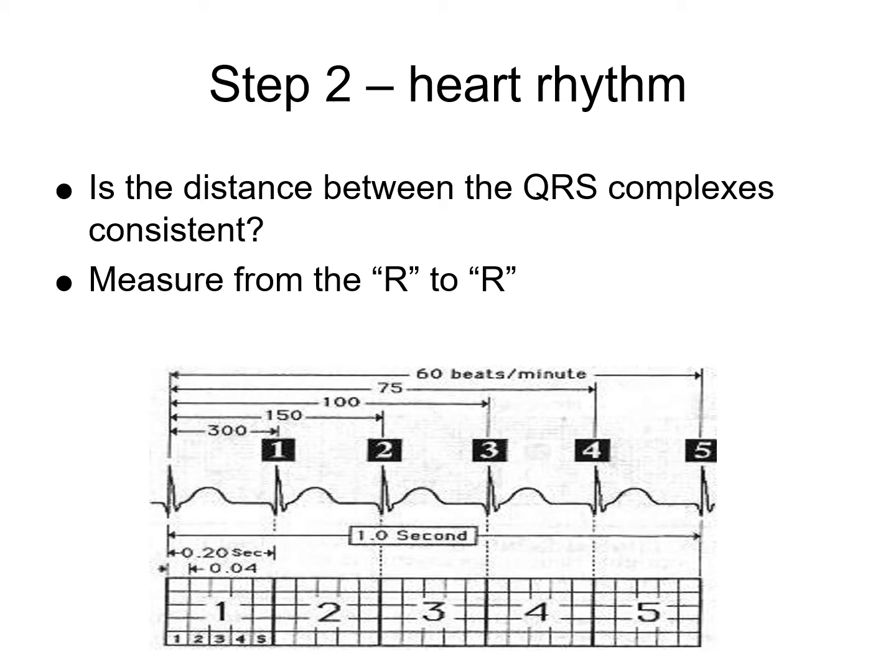So take a look at that Banner study guide. I believe that was posted on day 7, and that should also help you. This is showing a different method, the big box method of determining your heart rate. Let's say you have the big box there. So you have 300, if your rate is, hold on one second.